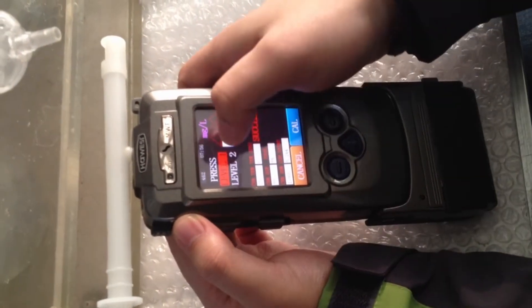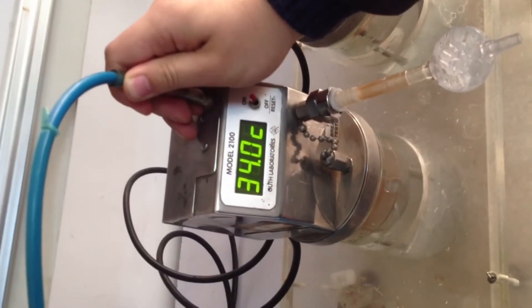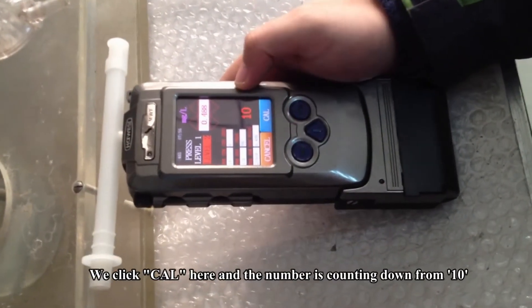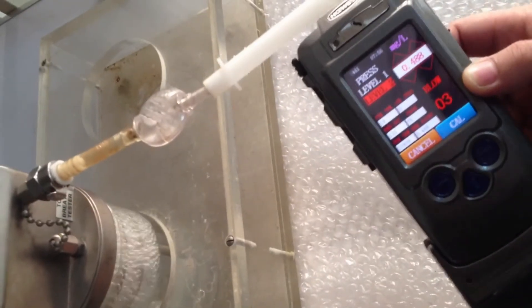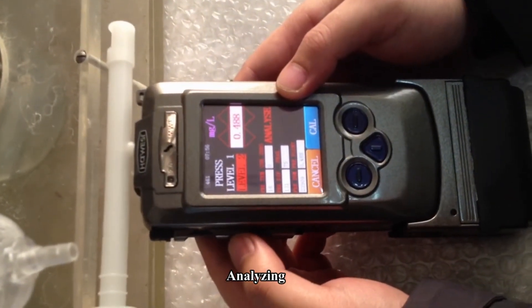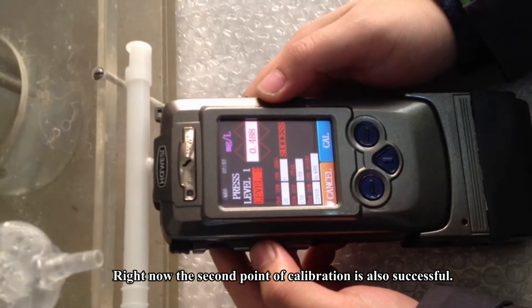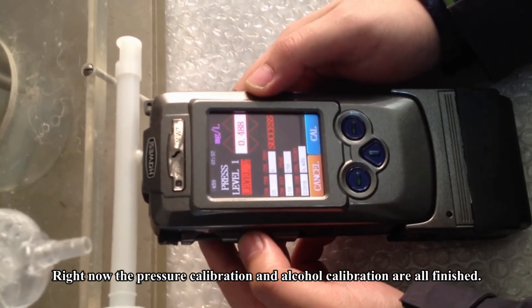Press Level 2. I also need to do some preparation — we switch the mouthpiece to the second one. Click the calibration key, the numbers count down from 10, we pump on, and when it comes to 3, blow. Analyzing. Success. The second point of calibration is also successful. Now the pressure calibration and the alcohol calibration are all finished. Thank you.